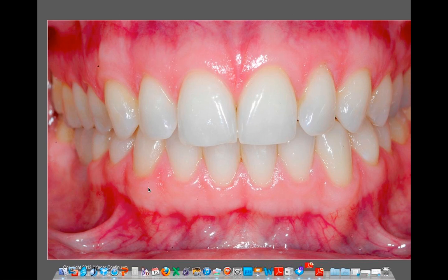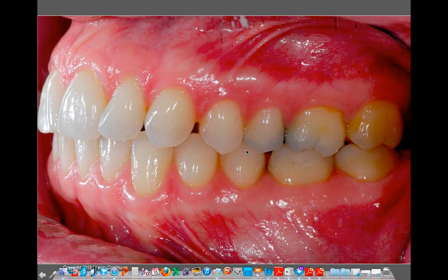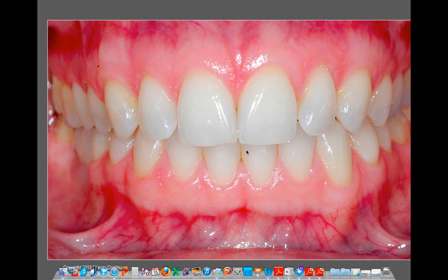Now we start getting into the images that give a bunch of you a little more trouble, and we'll talk about them later. But this is the retracted closed. And by the way, one image that I don't have here is a retracted open where we show the incisal edges open in this shot. You take this one, then you have them open a little bit, take that one.